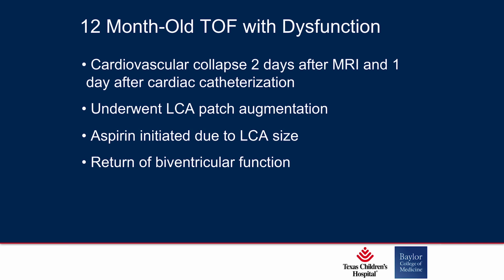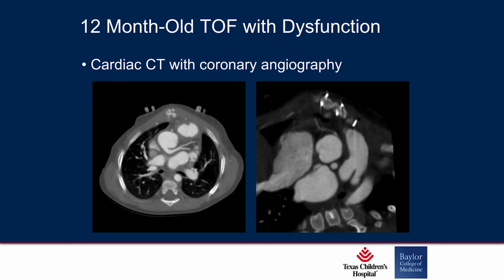While we were deciding, the patient actually had a cardiovascular collapse 2 days after the MRI and 1 day after the cardiac catheterization that confirmed this finding, and went for left coronary artery patch augmentation and has had return of biventricular function. Here's a look at the CT afterwards, and he is now on aspirin therapy.